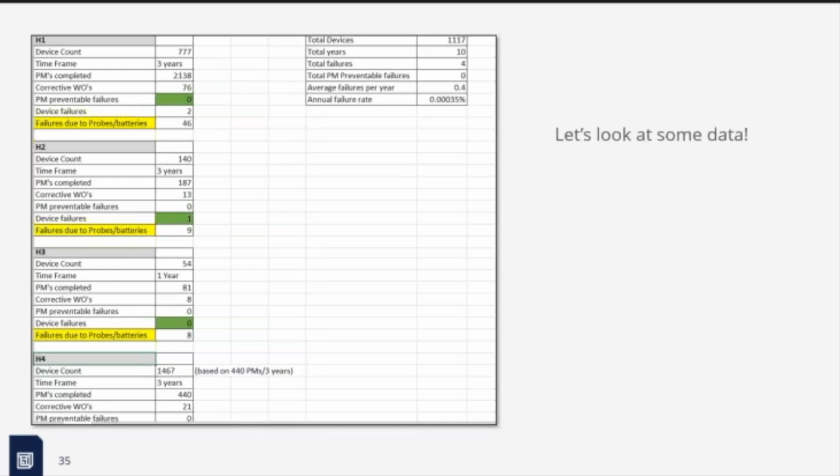So, again, other device types as well. This one had 1 failure. This one has 0 failures. So, in this scenario, is there any one of these you might not put in your AEM program? If it's hard to see, I understand that.